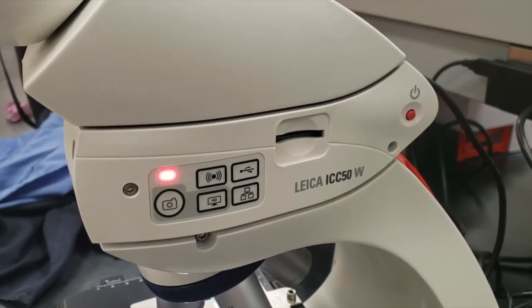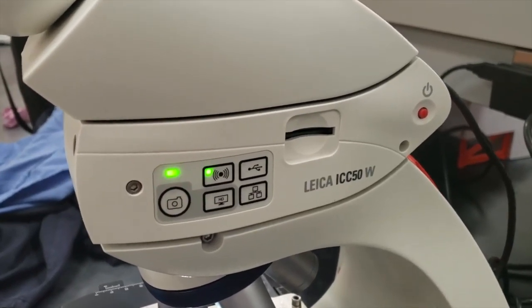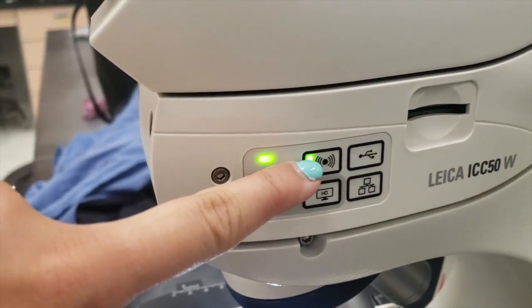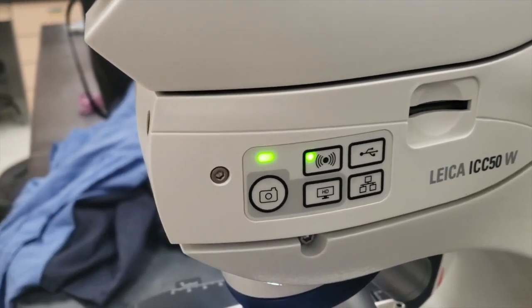Then, you're going to wait for the blinking red light to turn green above the camera icon button. If the camera scope is not on Wi-Fi, you're going to press the Wi-Fi icon on the top left corner.